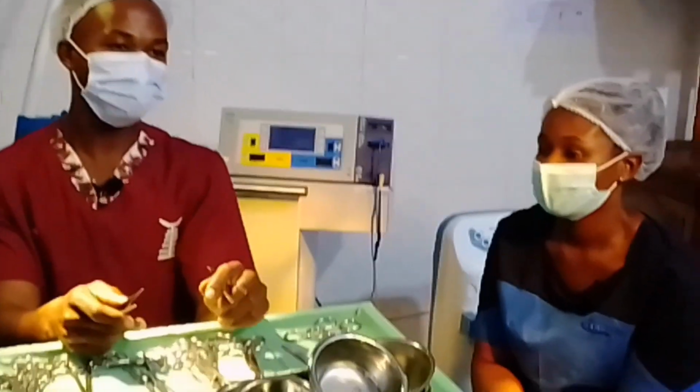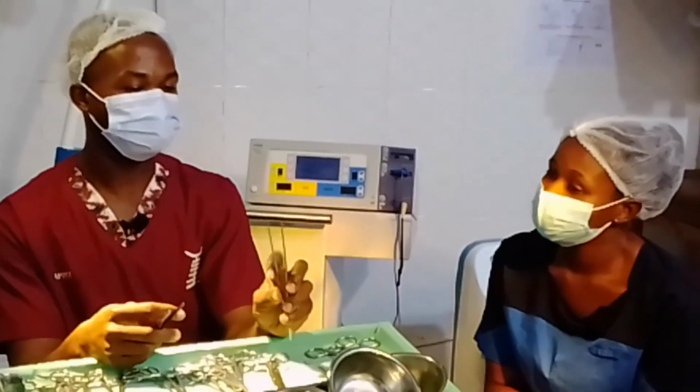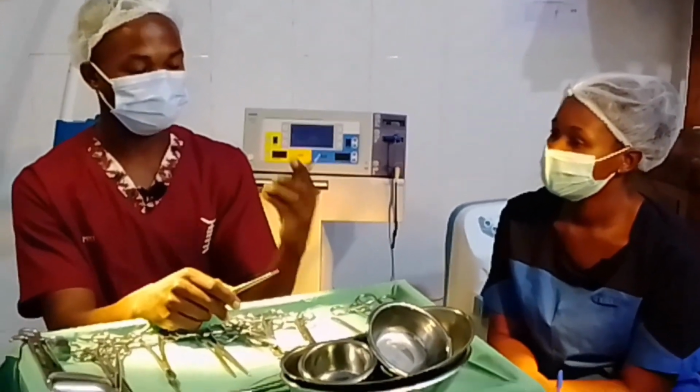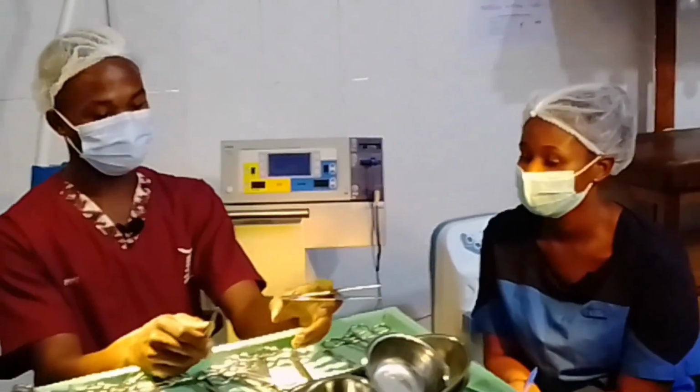Yes. Okay. For example, when you are suturing the uterus, you can't use this one. If not, you will puncture the uterus. So you must use the plain one. And when you are suturing the skin, you use the tough one because the skin is tougher. Good.